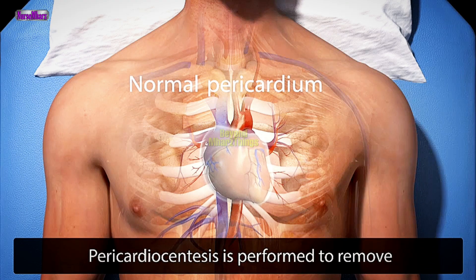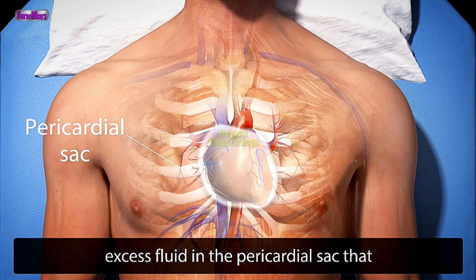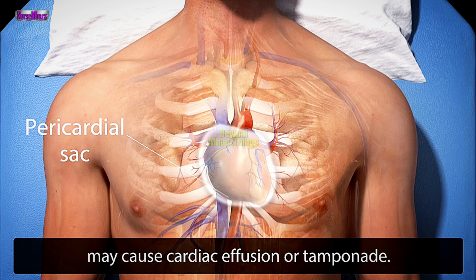Pericardiocentesis is performed to remove excess fluid in the pericardial sac that may cause cardiac effusion or tamponade.